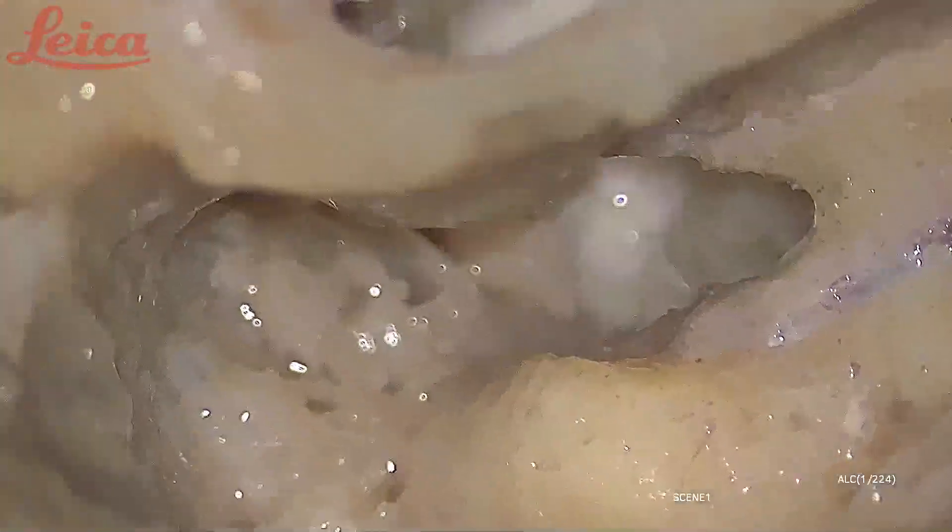I am working very close to the lateral semicircular canal, but as you can see I am not applying too much pressure — gently polishing the bone. You can see that this is in continuation with the horizontal facial canal which has already been delineated.